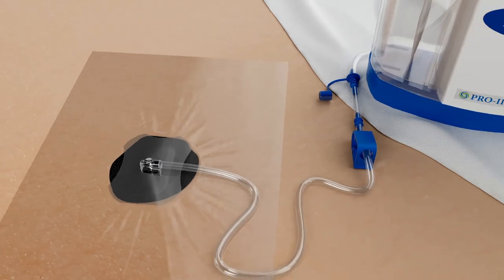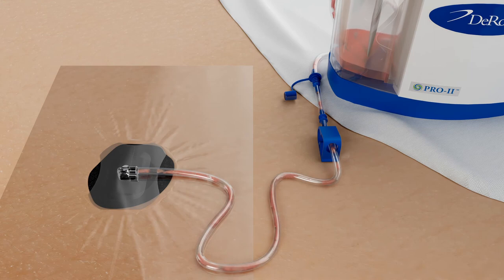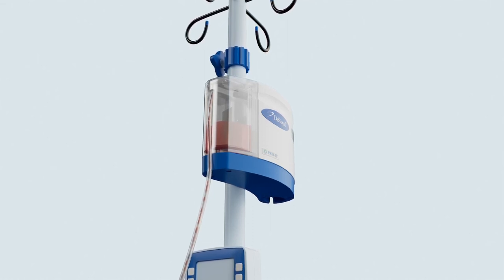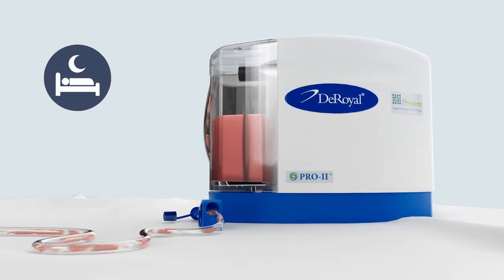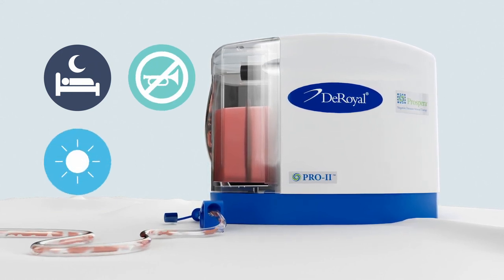During therapy, the Prospera NPWT system with Prospera Propel technology supports accurate delivery of negative pressure through the efficient management of fluid. The technology incorporates a specialized filter within the dressing dome, providing an environment for the effective removal of wound exudate from the dome cavity into the device canister. Prospera Propel technology performs efficiently while providing near-silent therapy, supporting patient comfort and discreteness across care settings and activities.